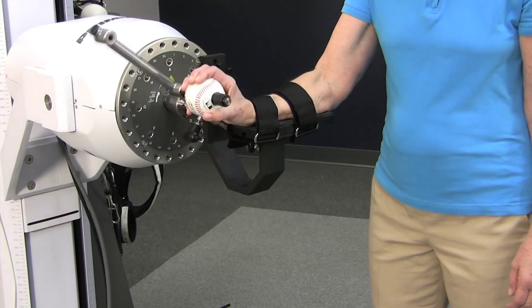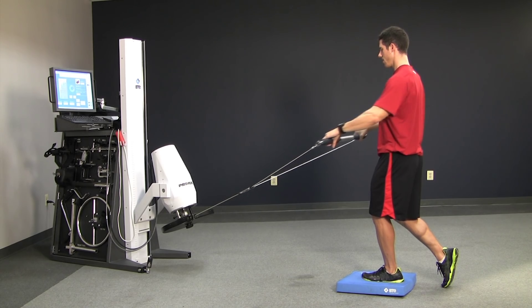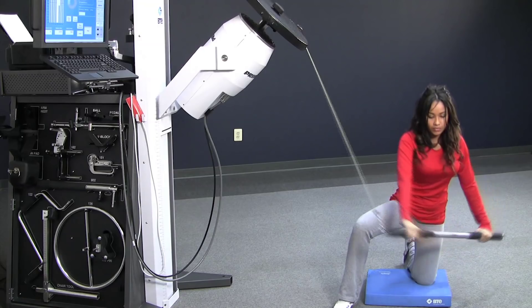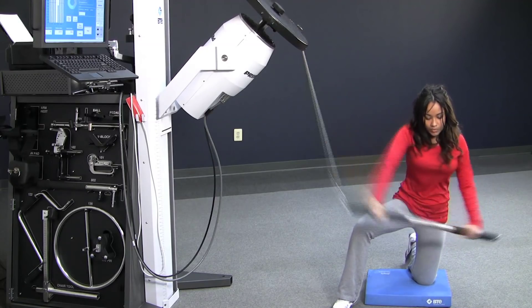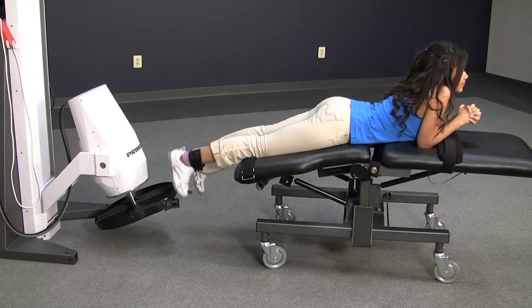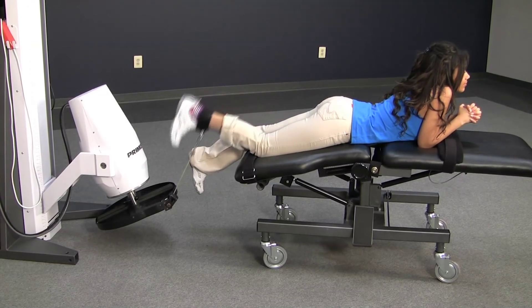Additionally, the Pro Package is a very popular option. It contains a number of tools that give you more flexibility for a broader variety of clients, ranging from ADLs and functional tasks to specific athletic applications.